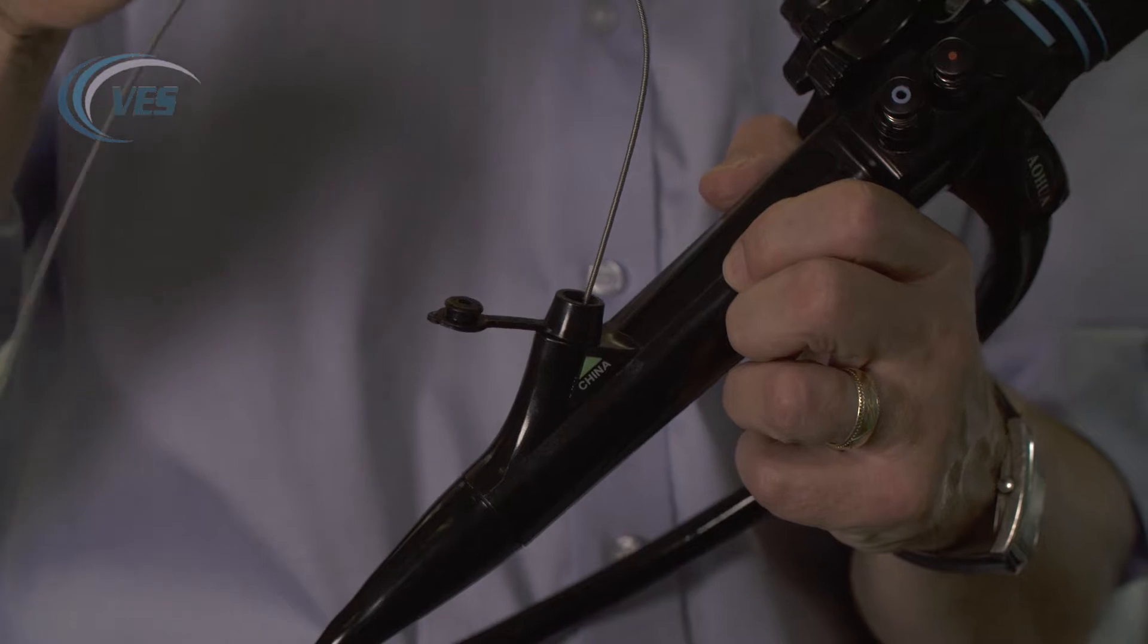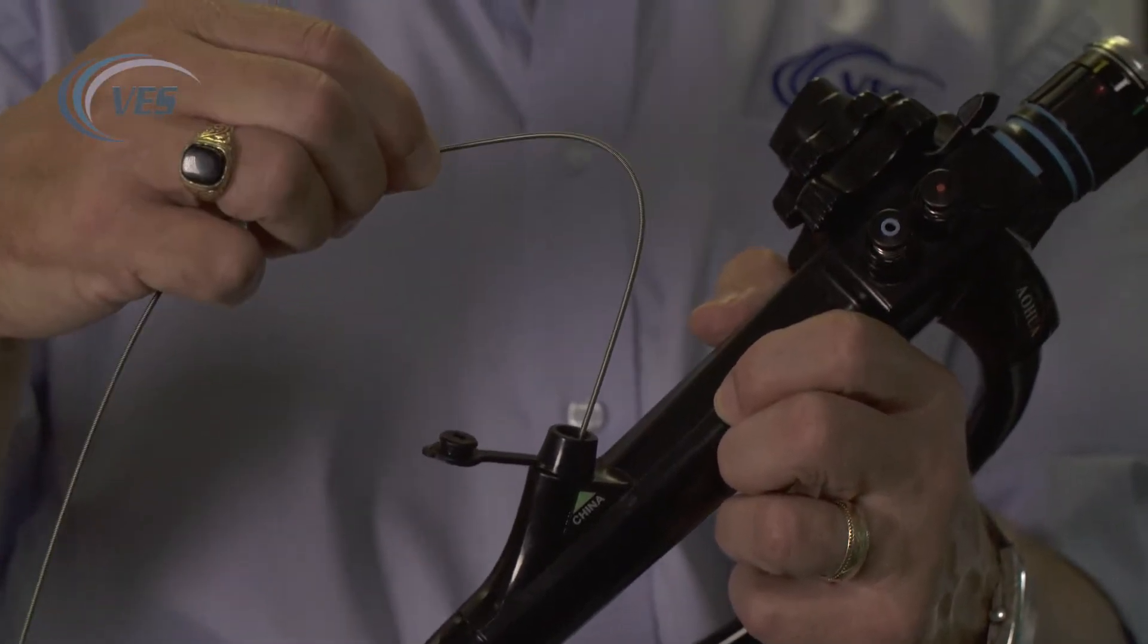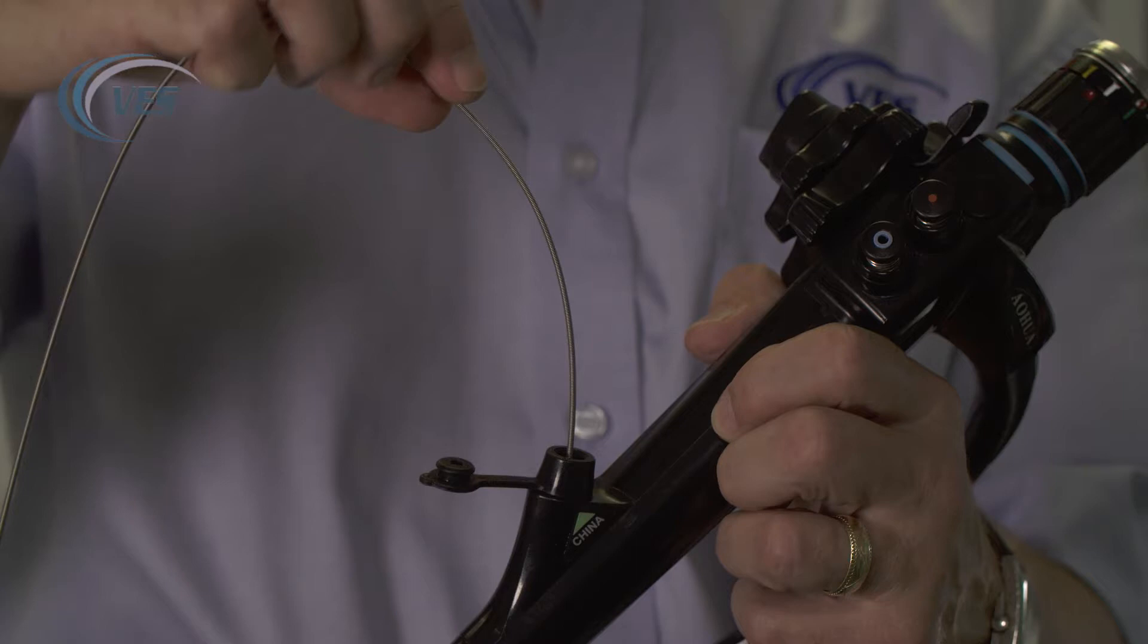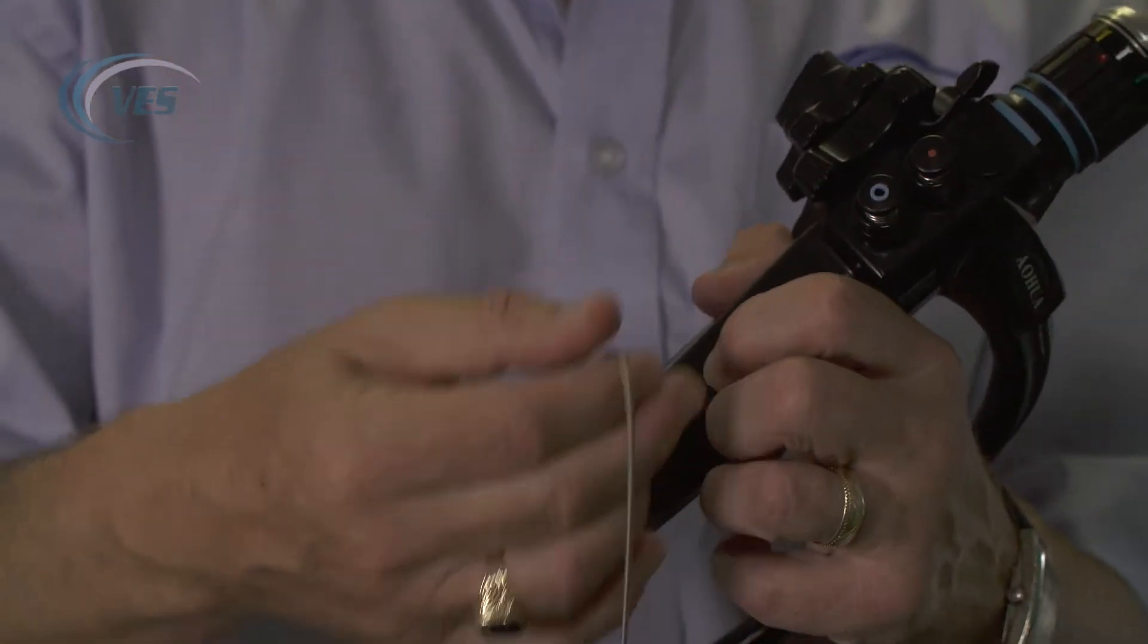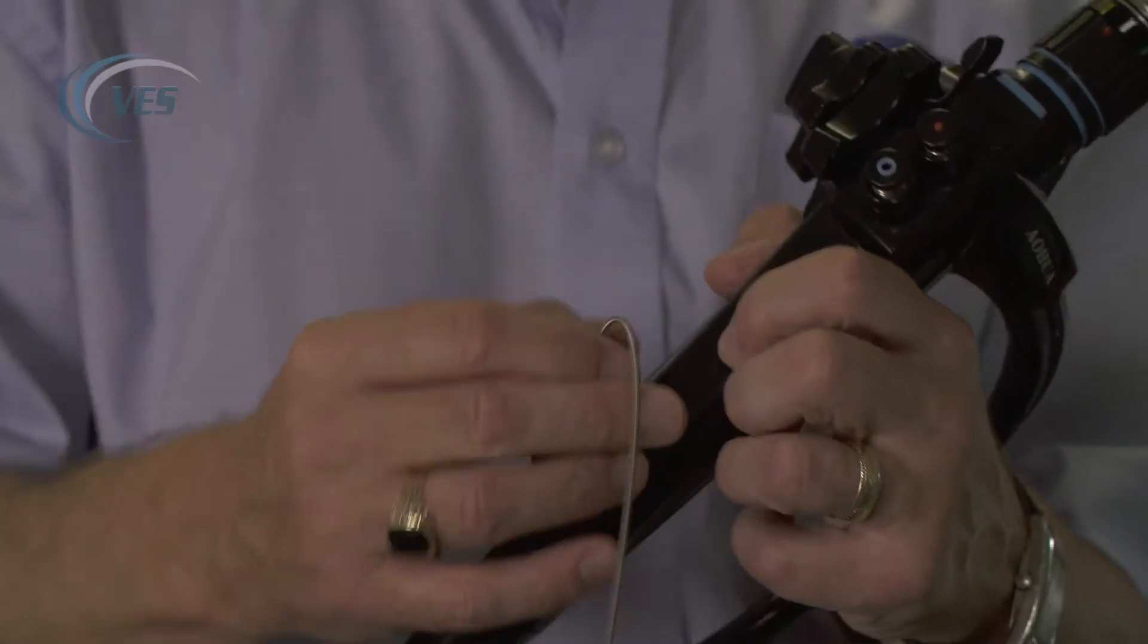Don't feed too far away because, as you can see, what happens here is it can cause a kink. The kink will eventually become sharp and will cause a lot of damage inside the scope.